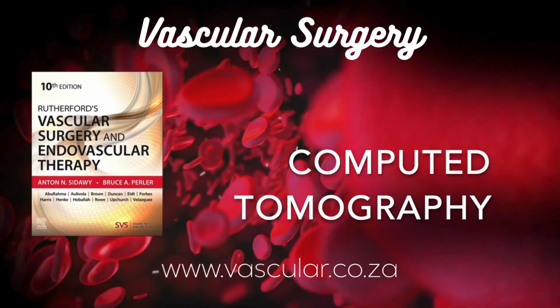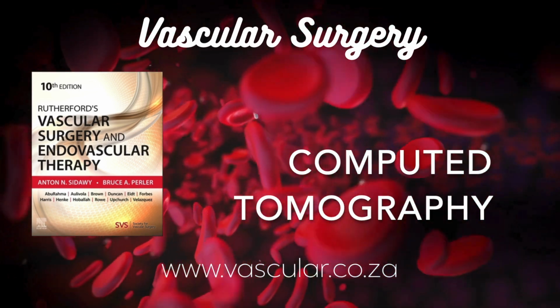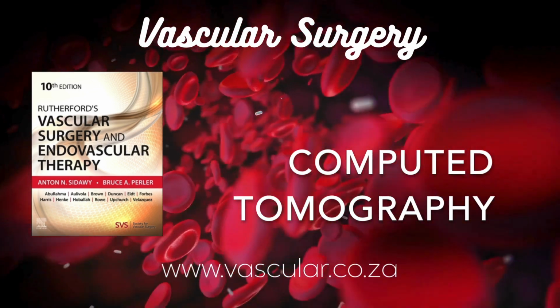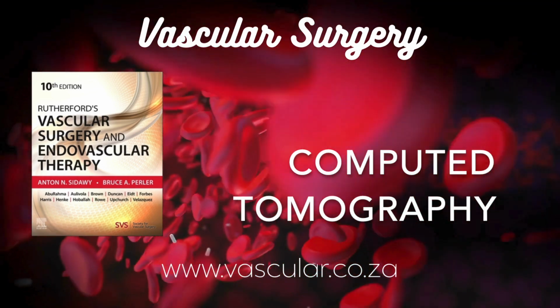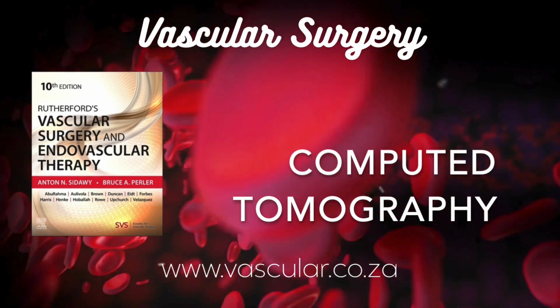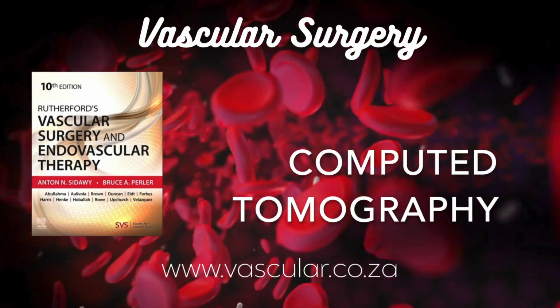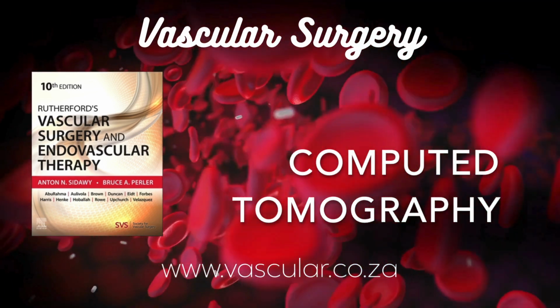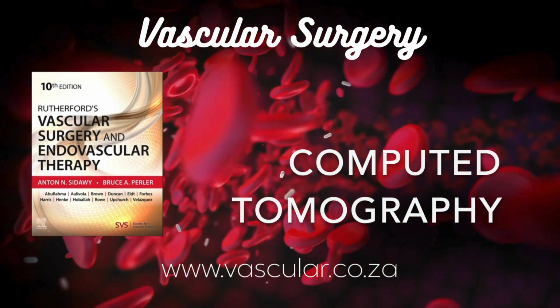And the first machines, where did they land? Hounsfield's first EMI scanner went into Atkinson Morley's Hospital in Wimbledon, UK, back in '71, and the first US one was at the Mayo Clinic. And the speeds, I read they were incredibly slow. Oh, painfully slow by today's standards. We're talking 4 minutes just to acquire the data for 2 brain slices. 2 slices. And then another 7 minutes for the computer, which was massive back then, to actually process that data and create the images. Hard to imagine now.